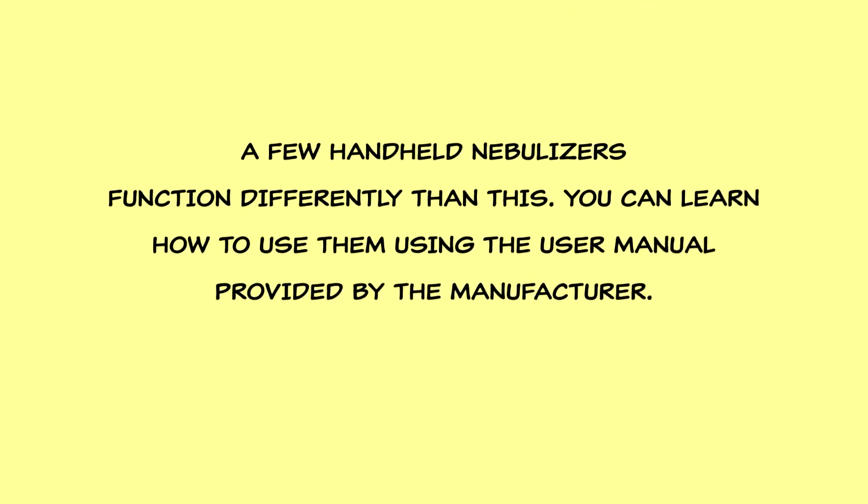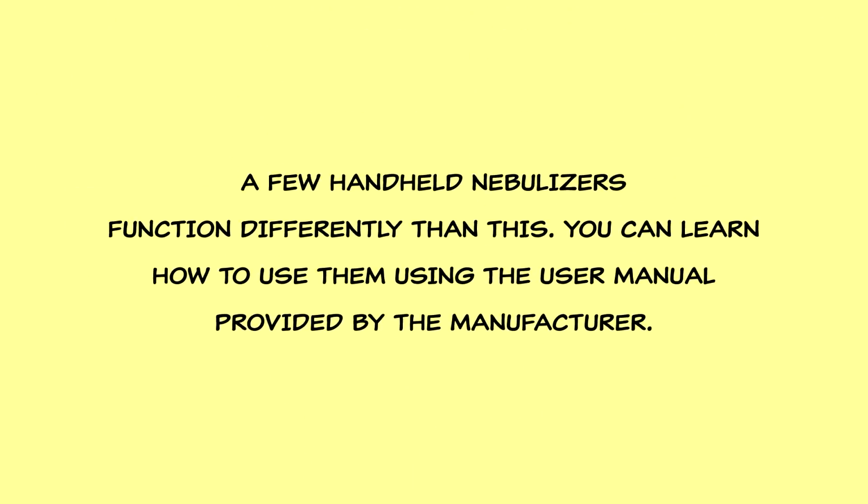A few handheld nebulizers function differently than this. You can learn how to use them using the user manual provided by the manufacturer.